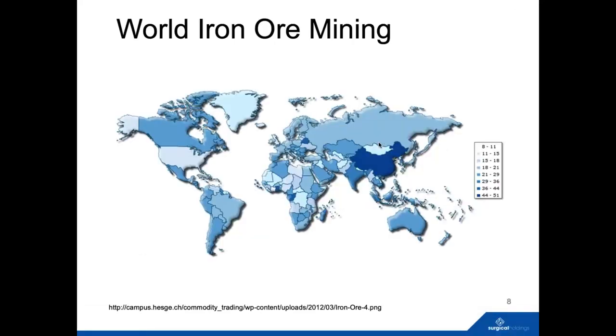To understand modern day surgical instrument manufacturing, it's good to know where iron ore is mined nowadays. Over in Asia, as you can see from this graphic, it's no real coincidence that as iron is mined from these areas, a lot of the stainless steel is produced in these areas, and no coincidence that a lot of instruments are manufactured in these areas too, which is of course fine.